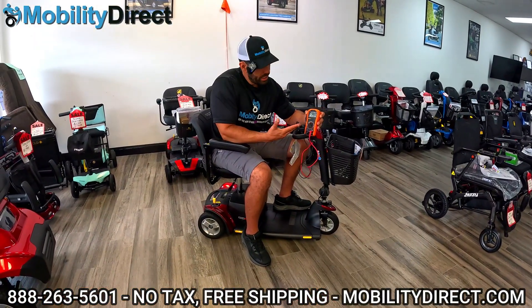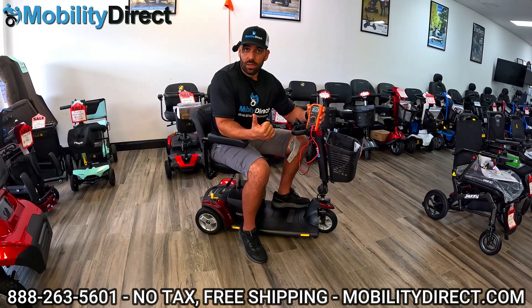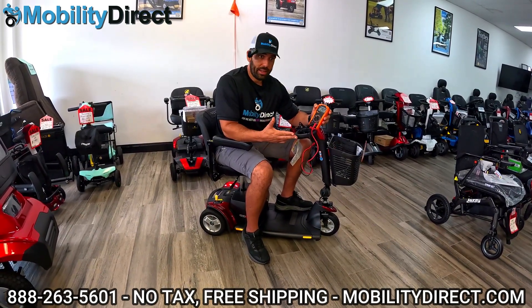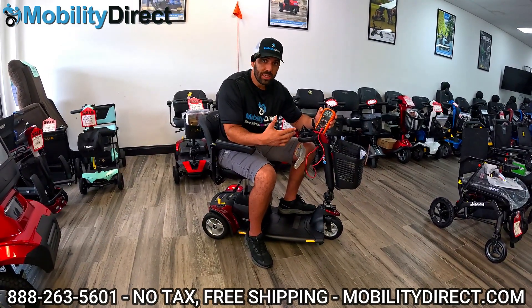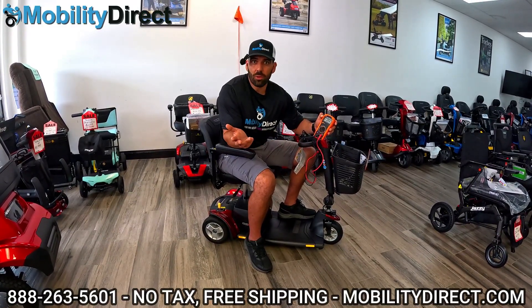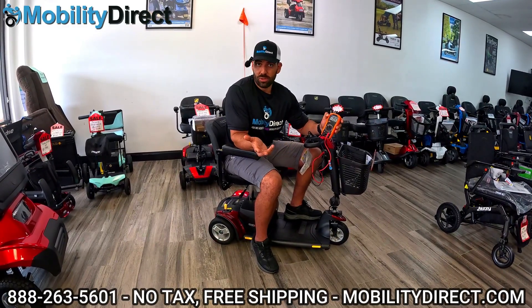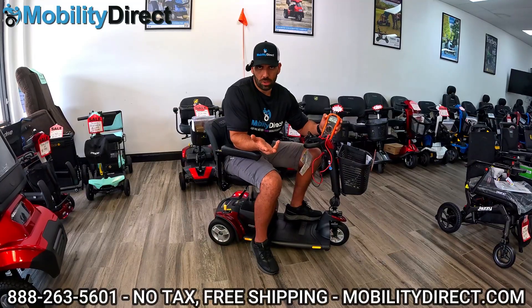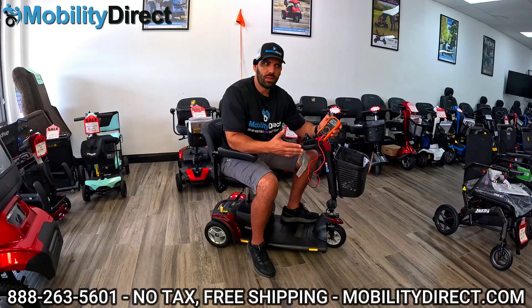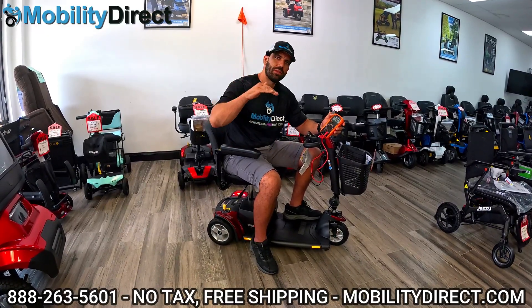Let's talk about your initial findings. If it's under 24 volts, your batteries are either dead and they need to be charged, or they're just not able to hold a charge. That happens a lot. A lot of customers come in and say, 'I charged my scooter all night, I go to use it in the morning, and I just go to the mailbox and it dies.' That usually means the batteries are just old and need to be replaced because they can't hold a charge for a very long time.